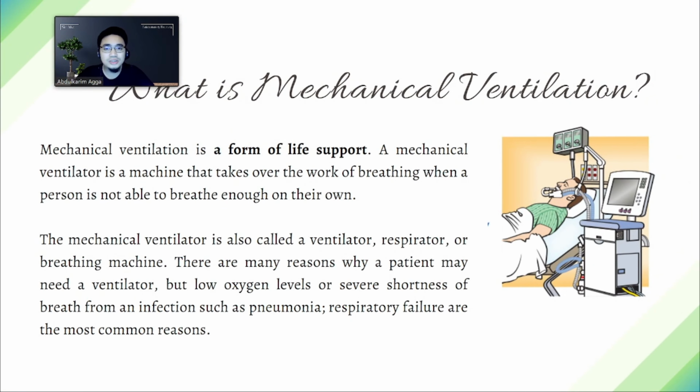Mechanical ventilation is a form of life support. A mechanical ventilator is a machine that takes over the work of breathing when a person is not able to breathe enough on their own. The mechanical ventilator is also called a ventilator, respirator, or some would call it a breathing machine in general.